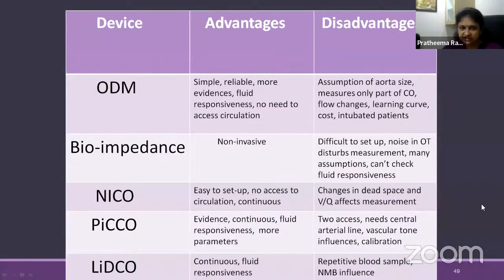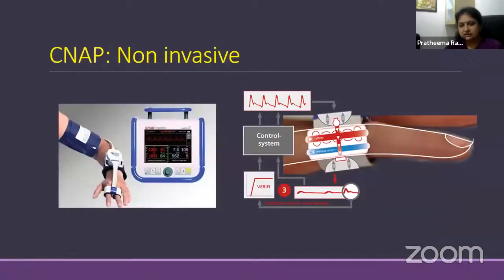So that's why I just mentioned it. We need to know what it is, but it is non-invasive, yes, but it is not very trustworthy as of now. And this is one of the latest things which we might see in our OT soon. So this is a non-invasive monitor, CNAP we call it. It is like a blood pressure cuff over the fingers.